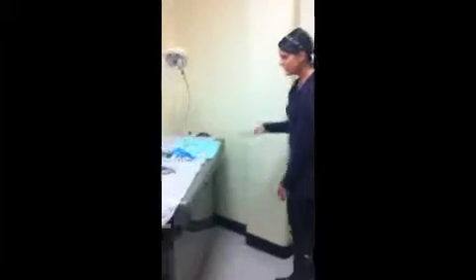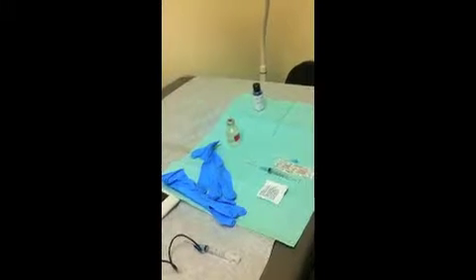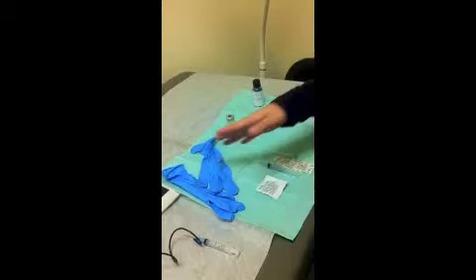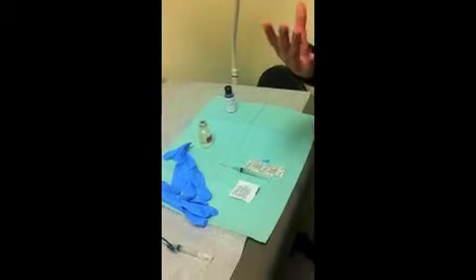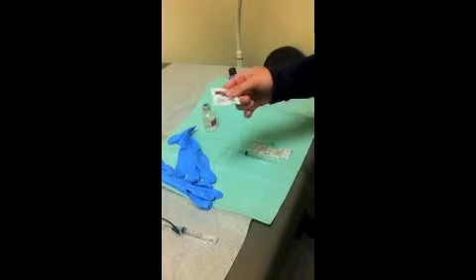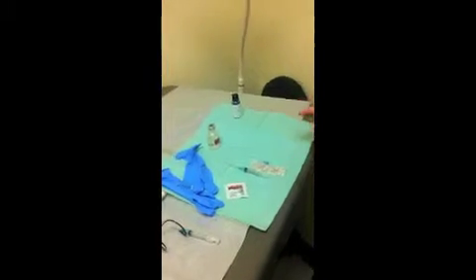So we will now talk about the supplies that we will use for this procedure itself. We have gloves. If we were going to anticipate an aspiration for possible culture and sensitivity, we'd want sterile gloves. These are clean gloves, as we didn't note diffuse or profuse swelling of the shoulder. We will use alcohol or proviodine preparation.